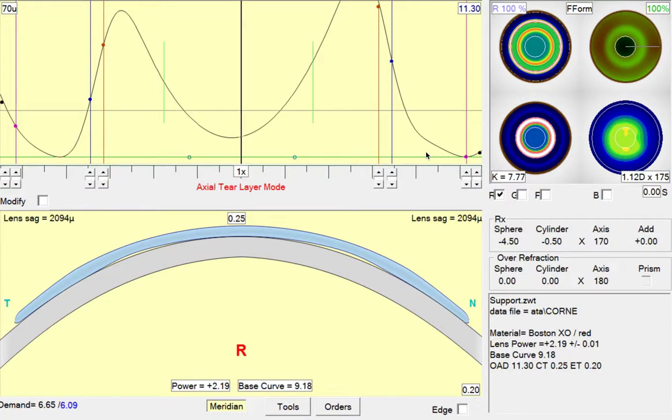In this orthokeratology case, we have a patient who's getting a good refractive endpoint, but the lens is decentering inferiorly and there's central staining on the cornea.